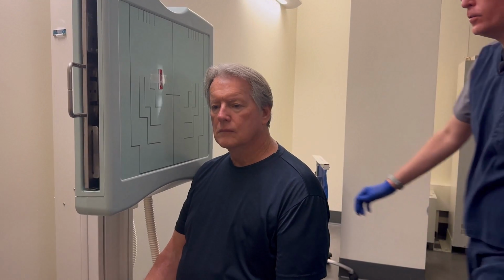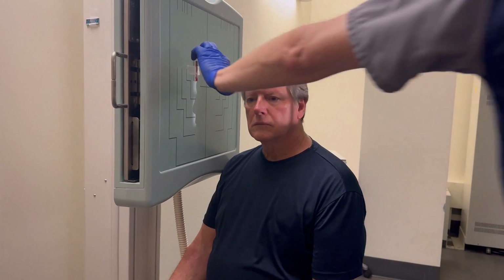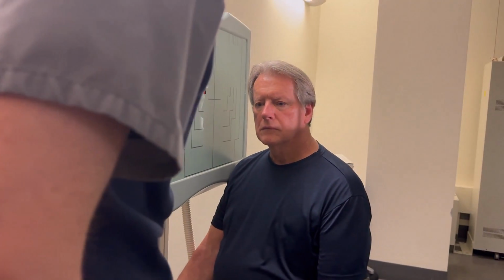Light to the EAM will include the sphenoid sinus. Light to the junction of the lips will show all of the maxillary sinuses. And then your light, depending on the patient, could be all the forehead, could be mid-forehead. You can adjust your field and line things up.